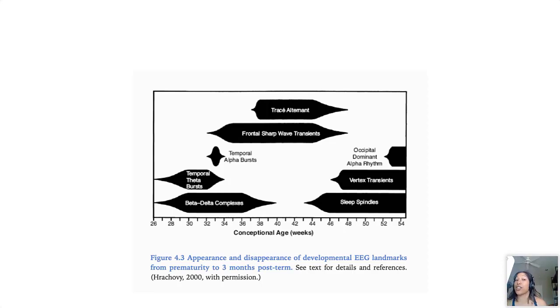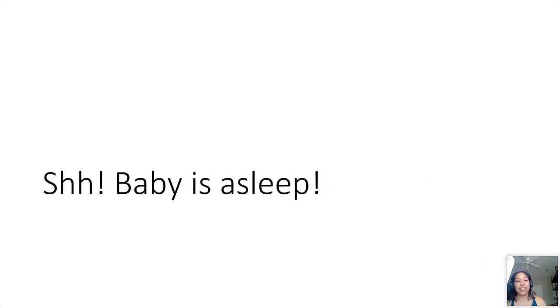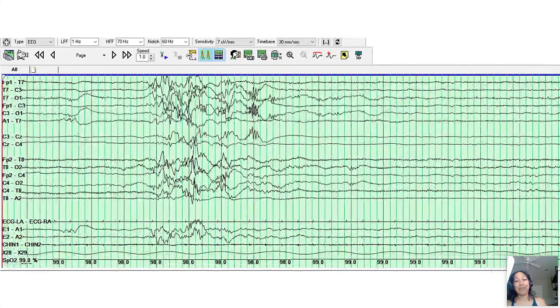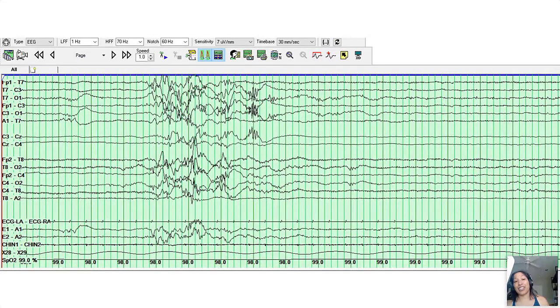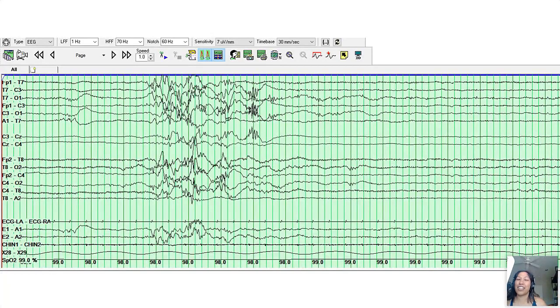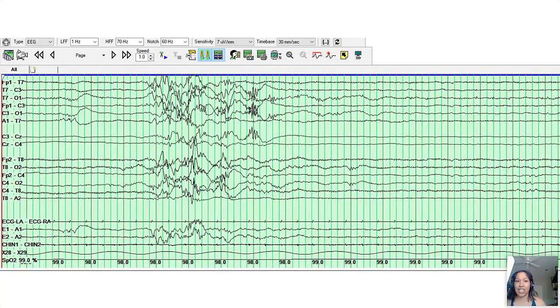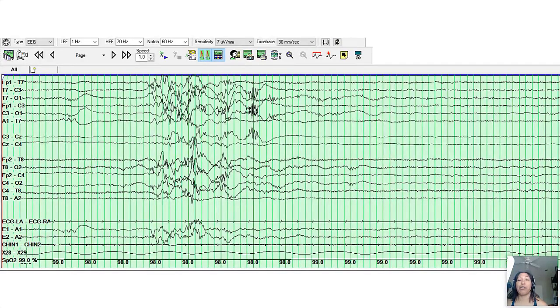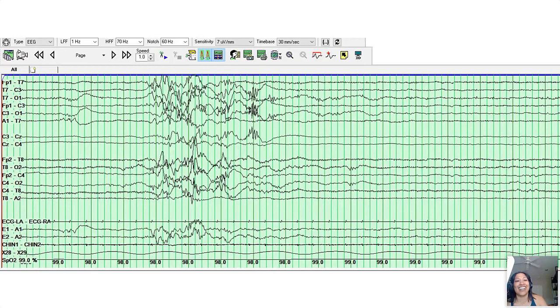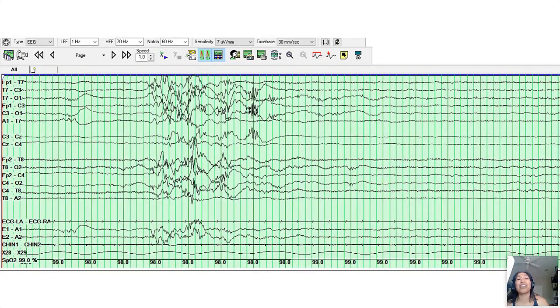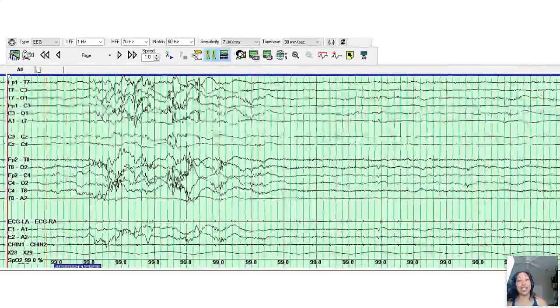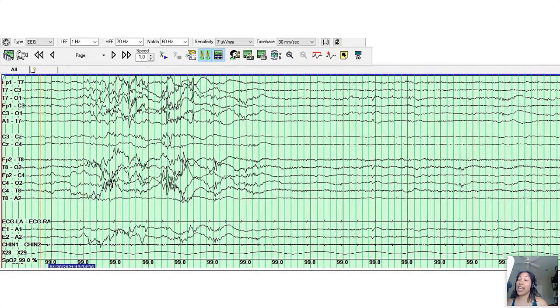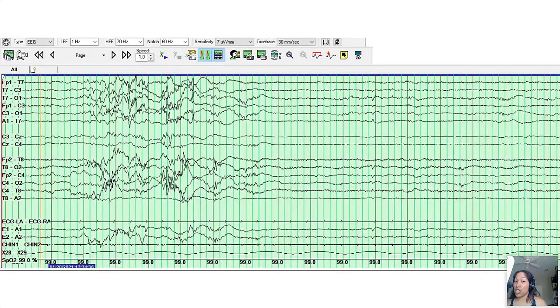Next, baby is asleep, what will we expect to see then? So in this baby we see that there's kind of a burst of activity and then generalized suppression. And if this were an adult EEG that would be very striking, that would be very unusual. It would look like burst suppression of some kind, either due to severe encephalopathy or some sort of pharmacologic treatment. But essentially in neonates we can have a discontinuous background and that's what we would call this, where you see polyfrequency activity followed by generalized suppression.